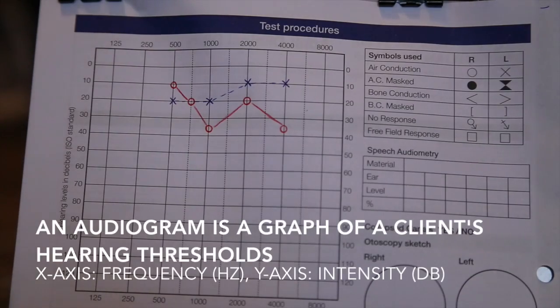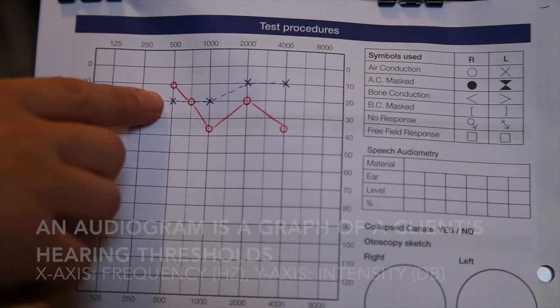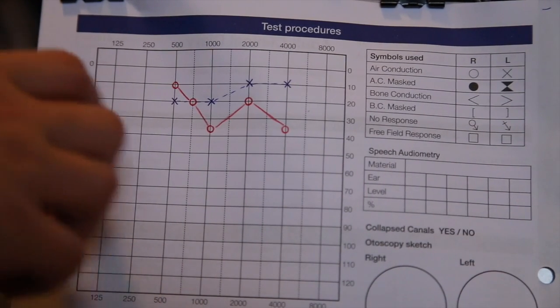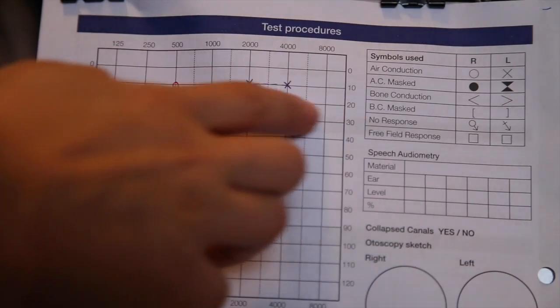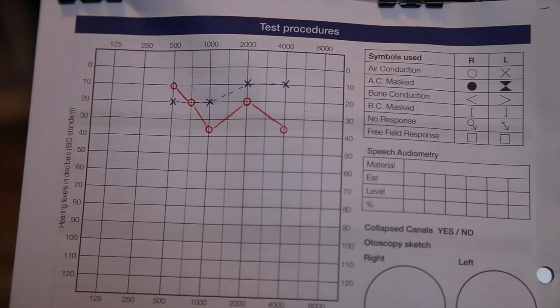Record the results in an audiogram. The right ear thresholds are conveyed as circles, whereas the left ear thresholds are crosses. You may wish to obtain the specific threshold of the client or you may wish to screen down to a certain set point. In the latter case, if you obtain a response for the pass mark, then you will move on to the next frequency.